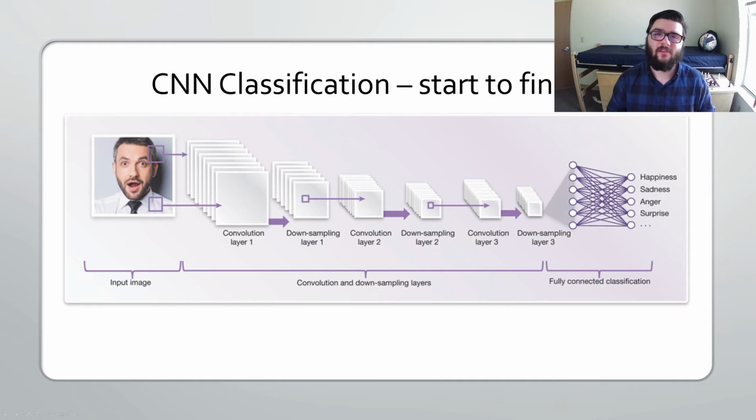So more specifically, let's talk about how our model works. And again, we use a convolutional neural network, or just CNN. So here you can see a very high level view of what a CNN would look like. You start with an input image, and that image is then passed through a hierarchy of convolutional and downsampling layers. And this is used to extract the important features out of the image. The final layer then outputs a feature map into a fully connected dense neural network. And that neural network is what makes the final prediction on the image.